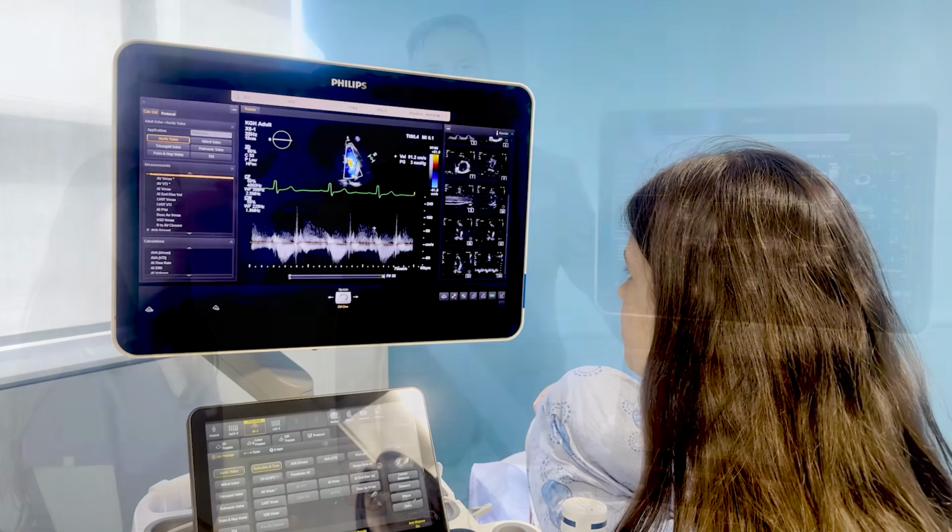Great. Okay. Well, that brings us to the end of today's session. As you can see, Casey was able to acquire images of the right ventricle and the right atrium. Today's example was a typical patient in which imaging of the right ventricle can be challenging. Nevertheless, implementing the new right heart and pulmonary hypertension guidelines is important.